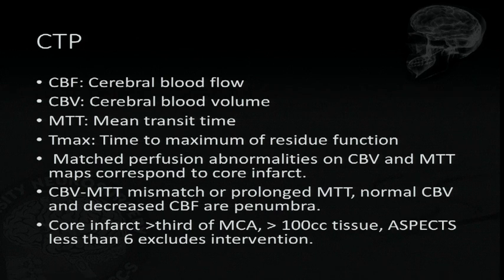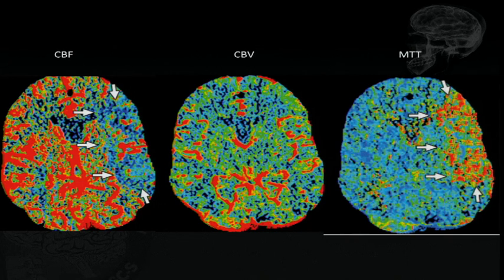That's what we used to do in our old CTP. So some of you may have done old CTPs, and then we obtained the CTP, then you went to the workstation to get these ugly images, and it took you 30 minutes to get that, and we never used them. So we stopped using that. But this is what you saw.